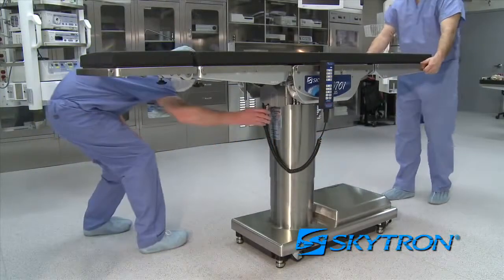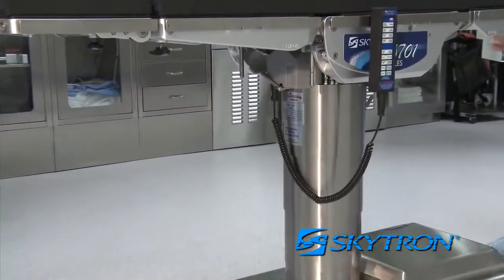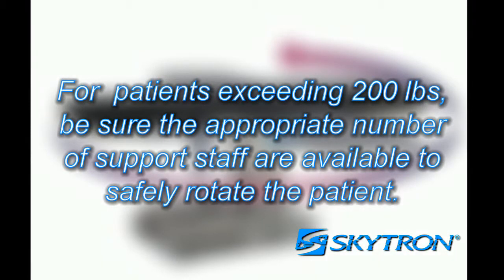Always be sure to lock the table once in the desired position to prevent unwanted table rotation. For patients exceeding 200 pounds, be sure the appropriate number of support staff are available to safely rotate the patient into final position.